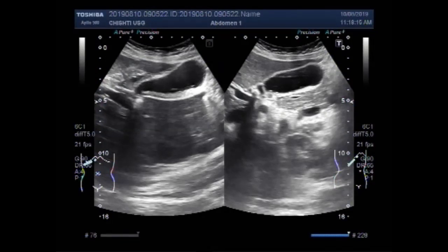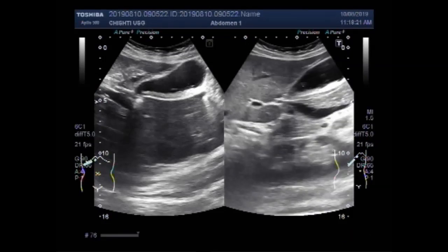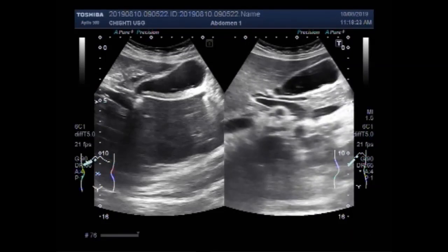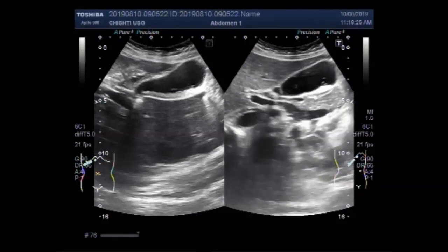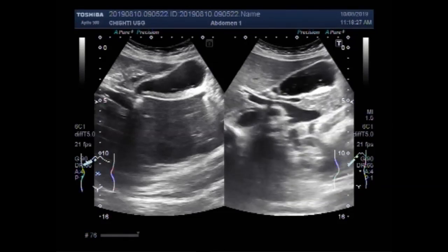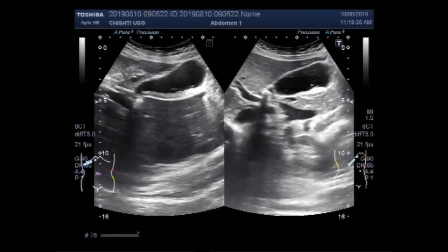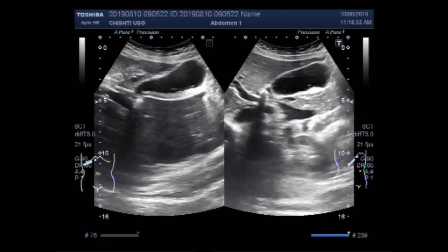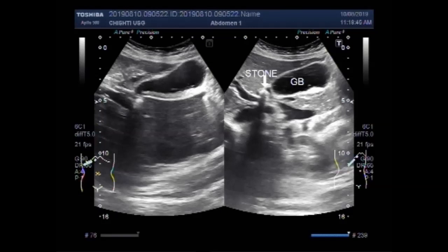There are two small videos showing gallbladder sludge, also known as biliary sludge. In this first video, gallbladder sludge is seen lying along the posterior wall of the gallbladder, and a stone is also seen in the neck of the gallbladder.